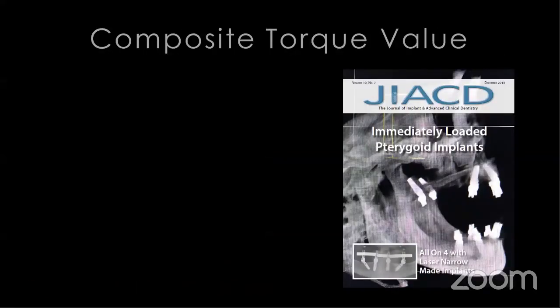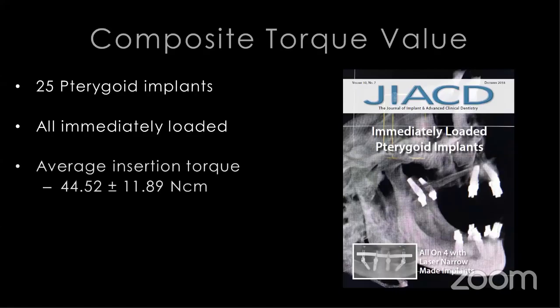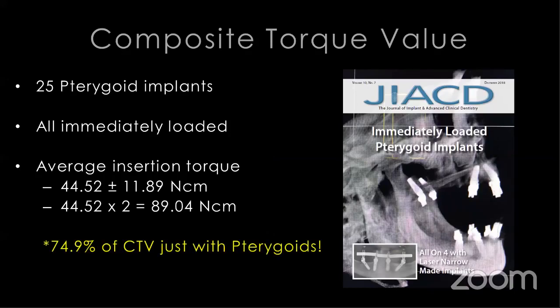So in 2018, I published an article in JACD, in which we placed 25 cases. And these were all immediately loaded. And the average insertion torque for these cases for the pterygoid implants was close to 45 Newton centimeters of torque. So if we're placing bilateral pterygoid implants, just those two implants are going to get us close to 75% of our composite torque value. So now we're going to place our anterior implants and we're very easily going to reach the remainder of our 120 Newton centimeters of composite torque value.